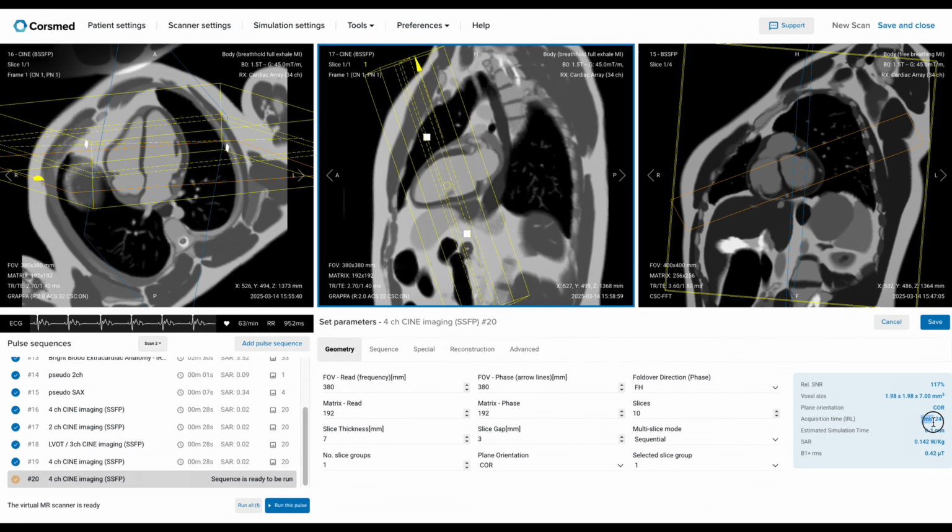In this case, the full short axis stack takes 1 minute and 24 seconds. So that means each breath hold will last about 10 to 12 seconds, which is manageable. I'm dividing that time across 10 slices. On your scanner, you should see the acquisition time per slice. That's your actual breath hold duration.